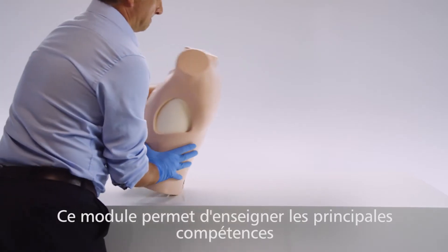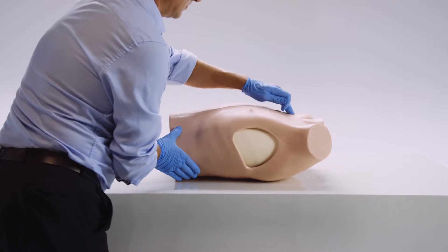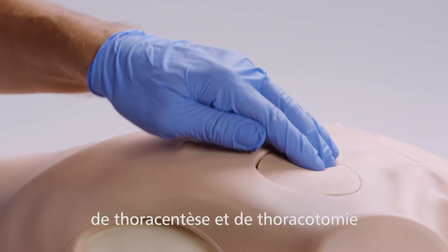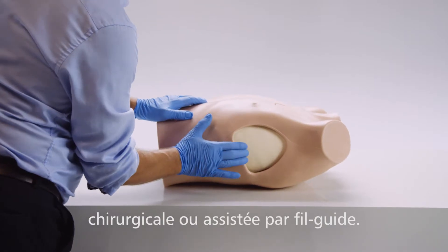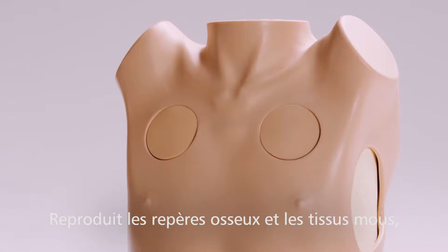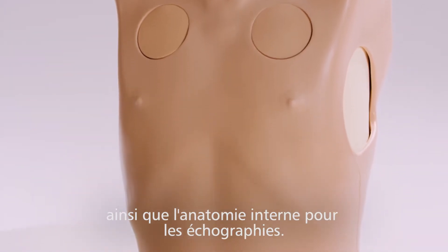The trainer covers the fundamental chest trauma management skills required of healthcare professionals training in surgical or guidewire-assisted thoracostomy and thoracentesis. It has been designed to include bony and soft tissue landmarks, as well as internal anatomy that can be viewed under ultrasound.